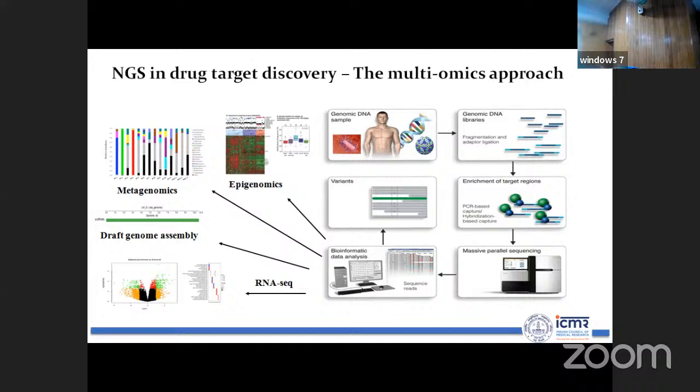And let me tell you, as I mentioned, it takes hardly a day or two for sequencing. Of course, library preparation takes some time. It takes hardly 7 days. To start a machine, you require library preparation time, machine cleaning, sequencing, then machine cleaning. So for one process you require 7 days, but sequencing takes only a day. So after 7 days you are ready with your report. What is the reason for the disease? Of course, it requires a lot of hardcore analysis. You need to interpret your data properly. That is quite important.